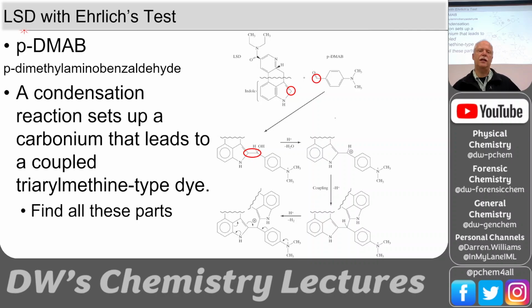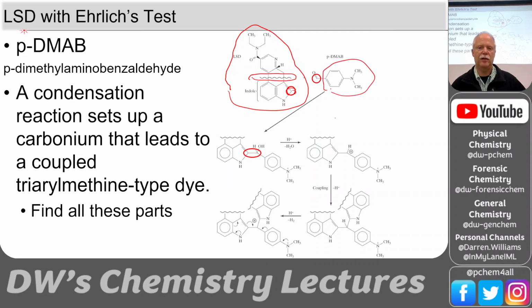Let's look at Ehrlich's test. This is testing LSD. So this is LSD. And again, I'm not going through all of these reactions so that you could rattle them off. They're pretty complex. But I want to show you, in this one in particular, how scientists try to simplify things. So look what they've done here. They've put this wavy line right here to show that this part of the molecule is not important. Okay, so this PDMAB comes in and reacts with this carbon here. And so now this molecule, I'll call that, well, I don't know, it's this piece right here. And this is the LSD, and right here, LSD. And so that wavy line just saves them the time of putting all of that stuff on there. They're just showing you what it reacted with. Okay.